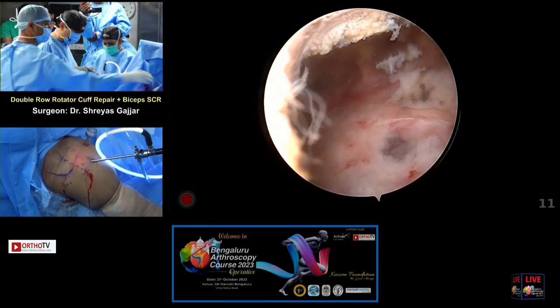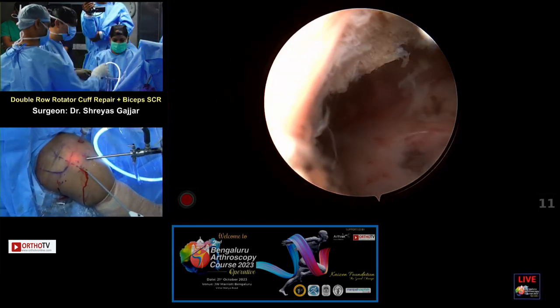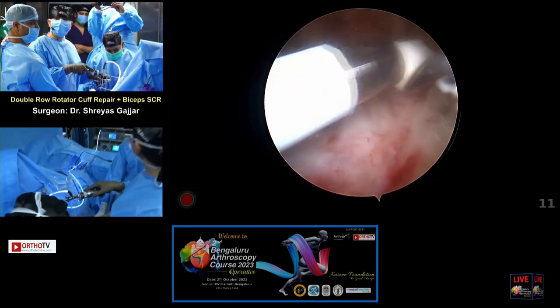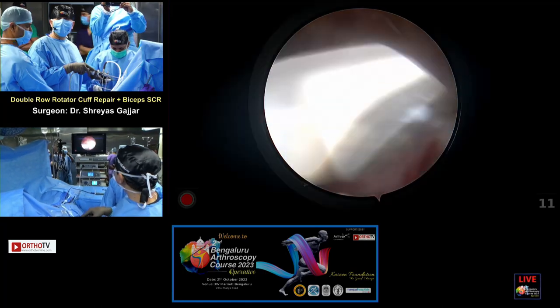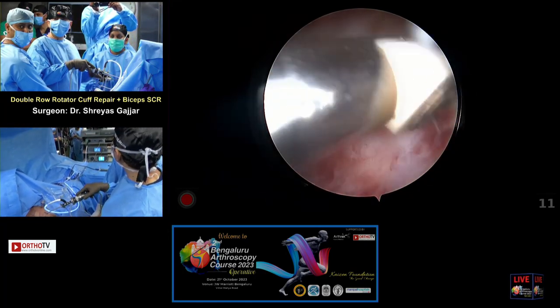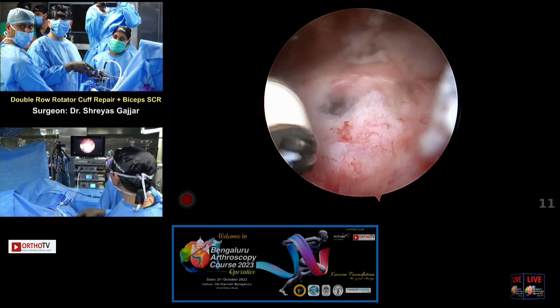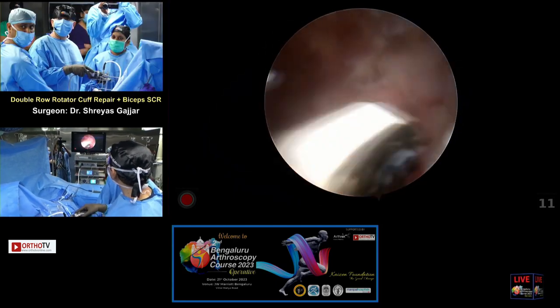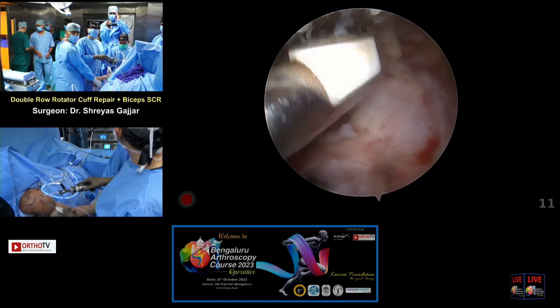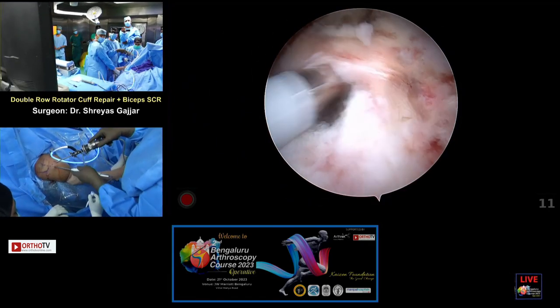RF. So, you prefer to keep your monitor at the foot end of the table, is it? Yeah. In my OT at Kokilaben, I also have a viewing screen where the curtain is, so my assistants can look straight, they don't have to turn to the right shoulder. For me, I'm quite used to this, so it's just surgeon preference. I don't think there are hard and fast rules. Absolutely.